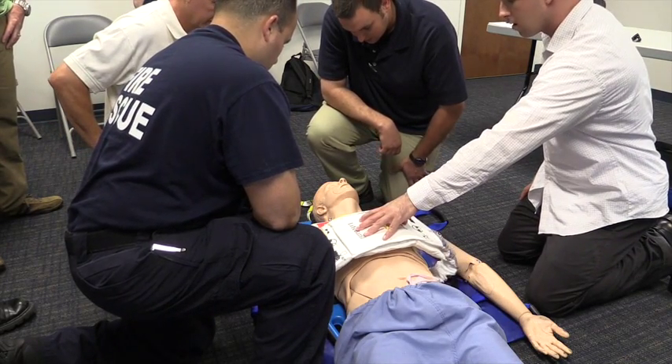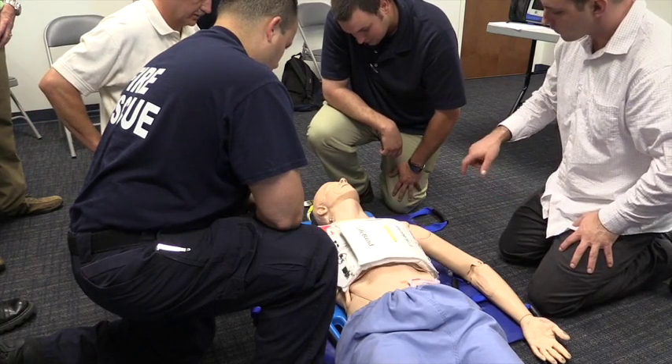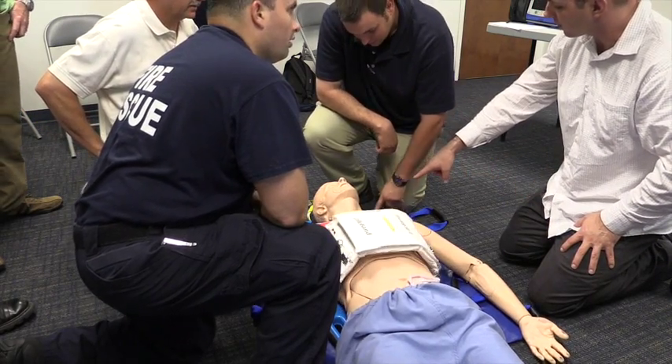Instead of doing CPR like we mainly would with the hand over the sternum and compressing downward, this is a band that's wide and it encompasses the whole thorax. The heart, when it beats, squeezes from the top and then squeezes from the bottom — it's a dual action.